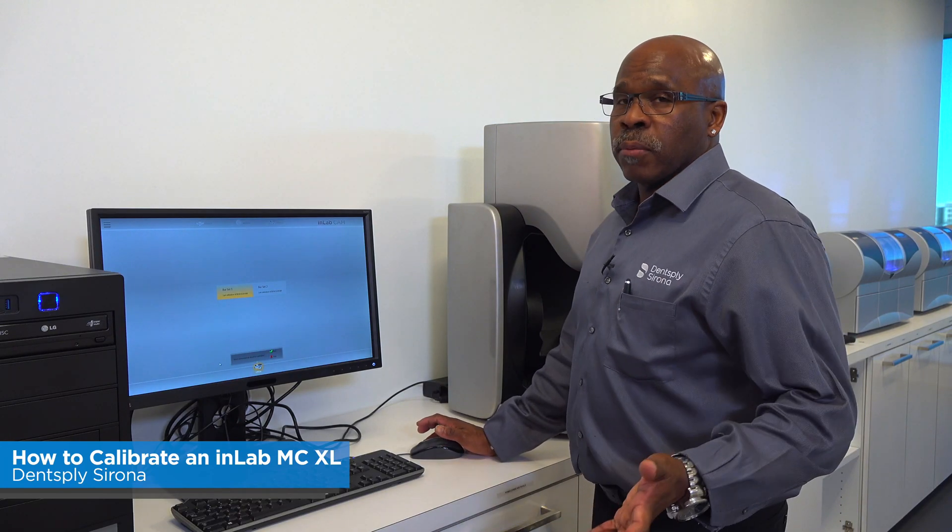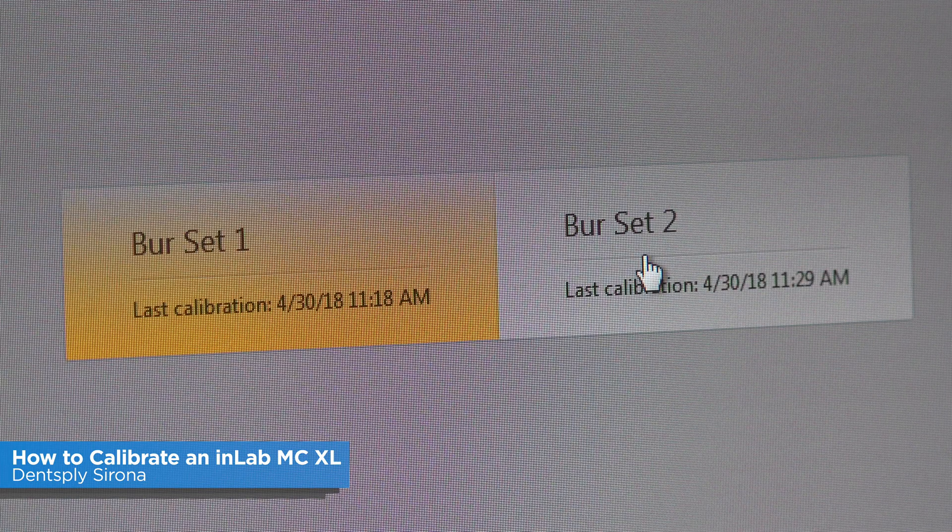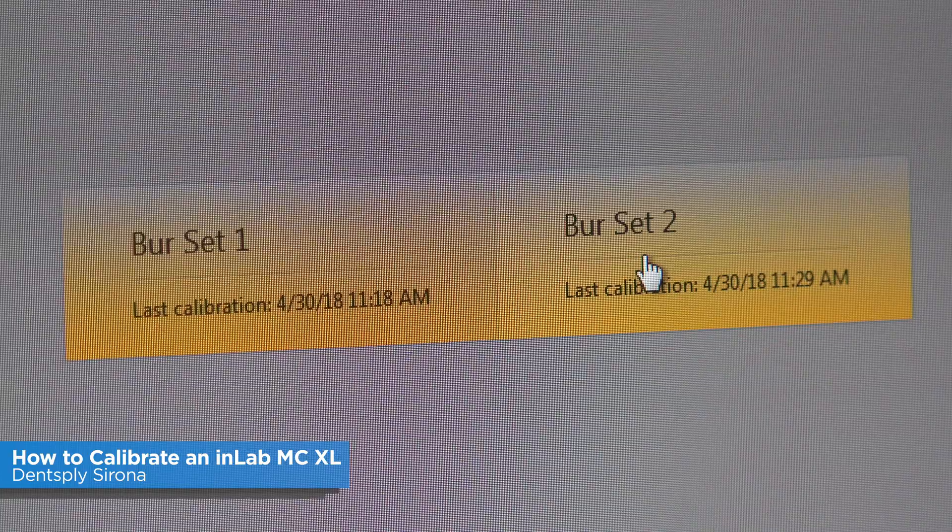This is where you're going to pick what burs you're going to be calibrating, because you have two motor sets. You always want to make sure you highlight both motor sets so it will calibrate both bur sets.